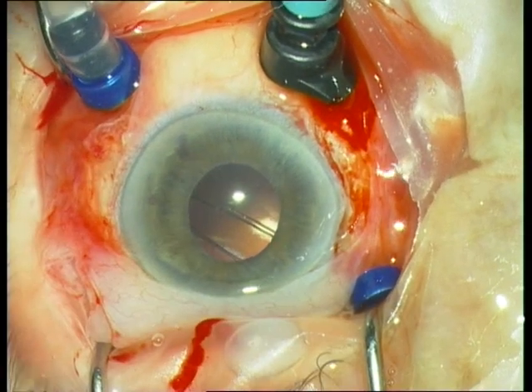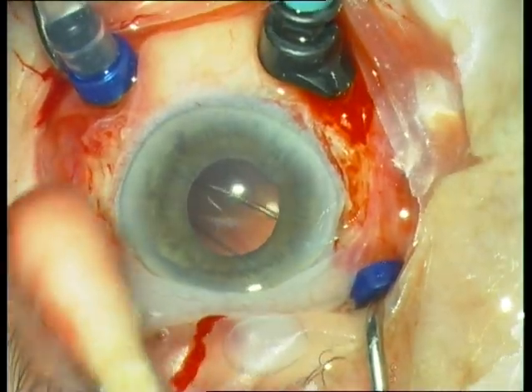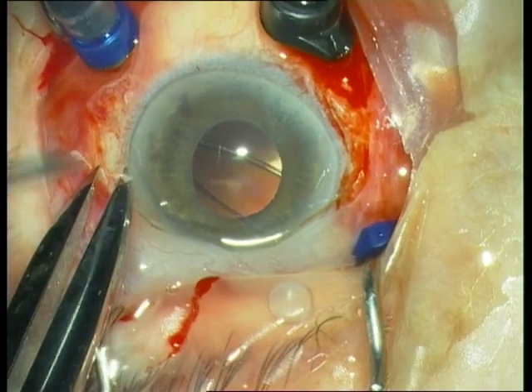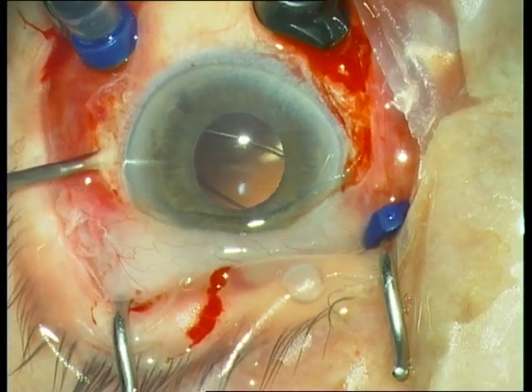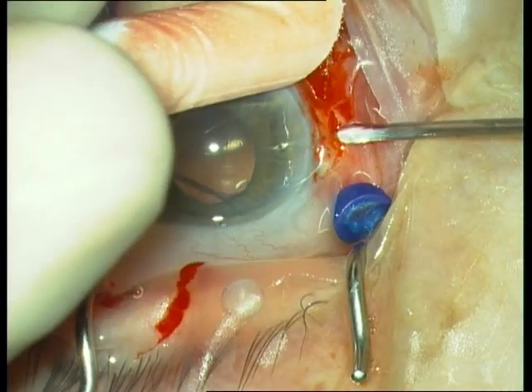Next we place two sclerotomies 1.5 mm behind the limbus at 3 o'clock and 9 o'clock using the 20-gauge sclerotomy knife.